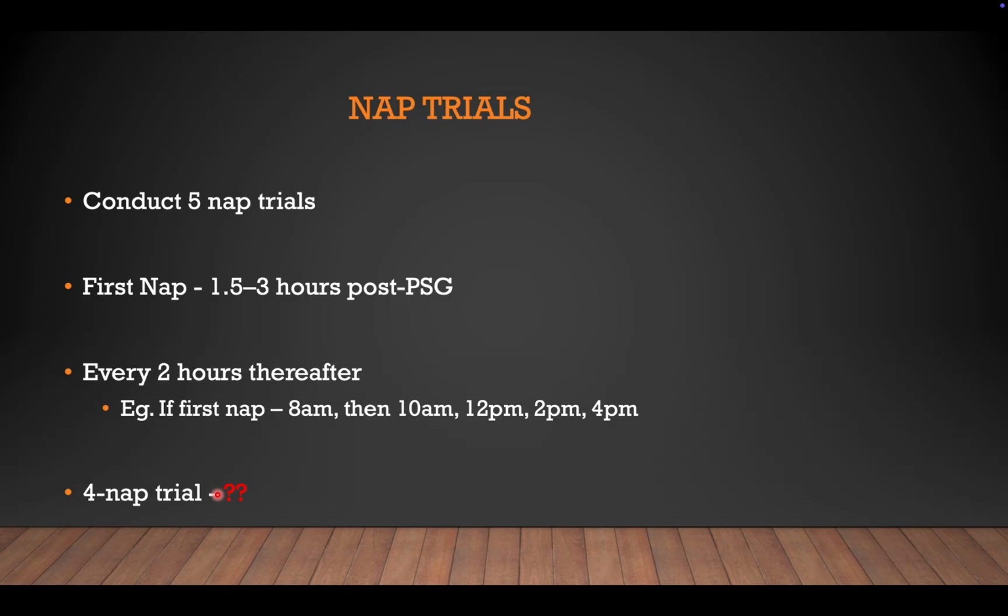And now let's do the MSLT trials. So usually 5 nap trials are conducted. The first nap usually starts from 1.5 hours to 3 hours post PSG, which means that, for example, if the patient's sleep study ends at 6 a.m., the first nap can be started as early as 7:30 a.m. or as late as 9 a.m. And from the first nap, start every 2 hours thereafter.